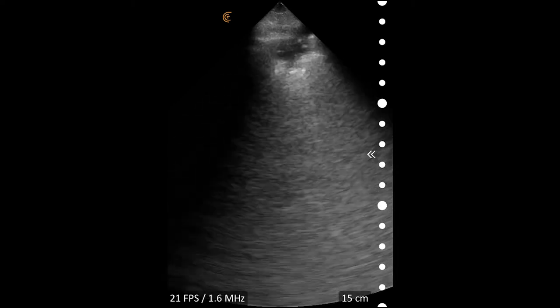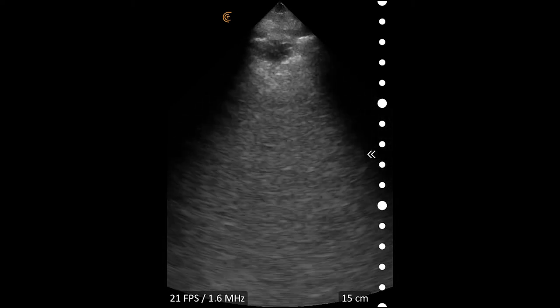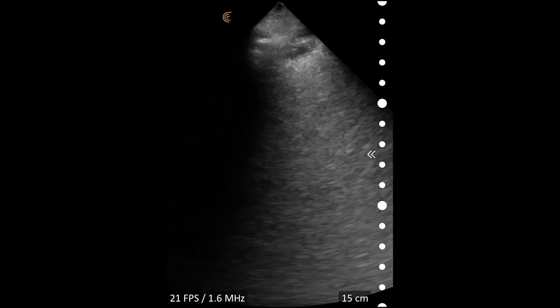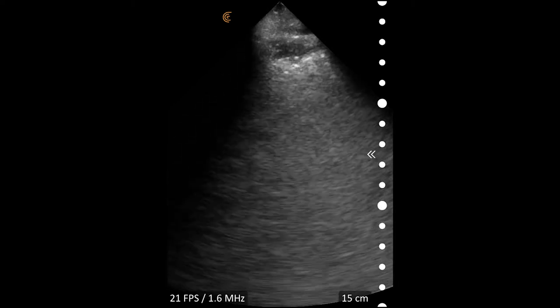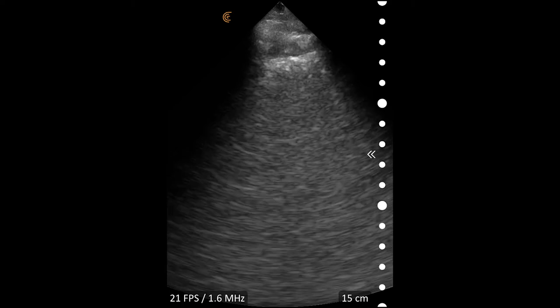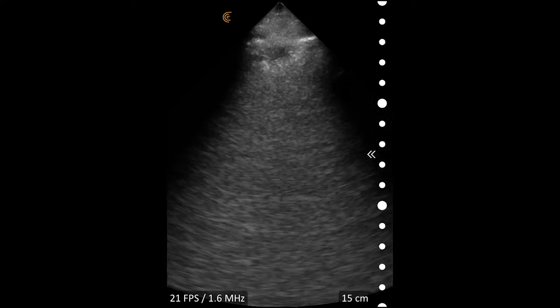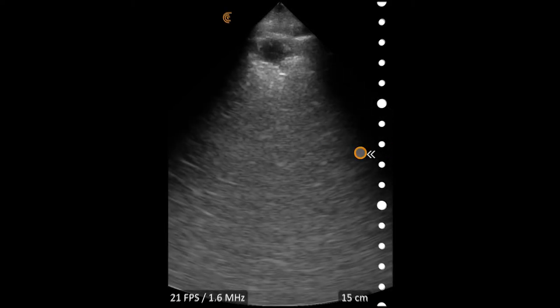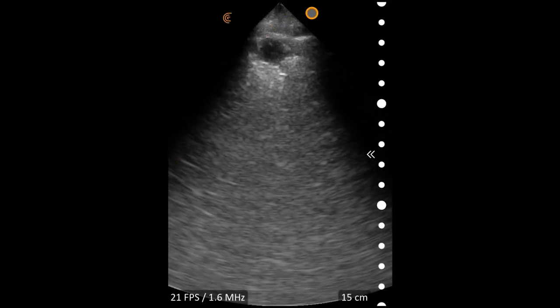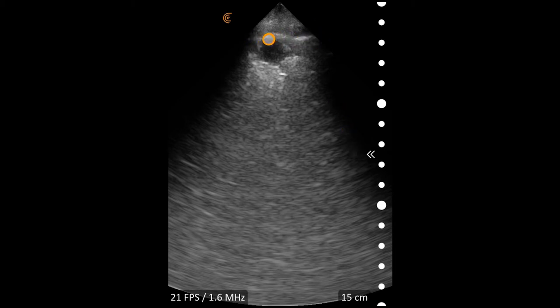In this video, we see the phased array scanner on a lung or abdominal preset here in the sagittal plane in the thorax. Here we see a rib shadow coming down and another rib shadow. Up at the top is the bright line of the pleura.